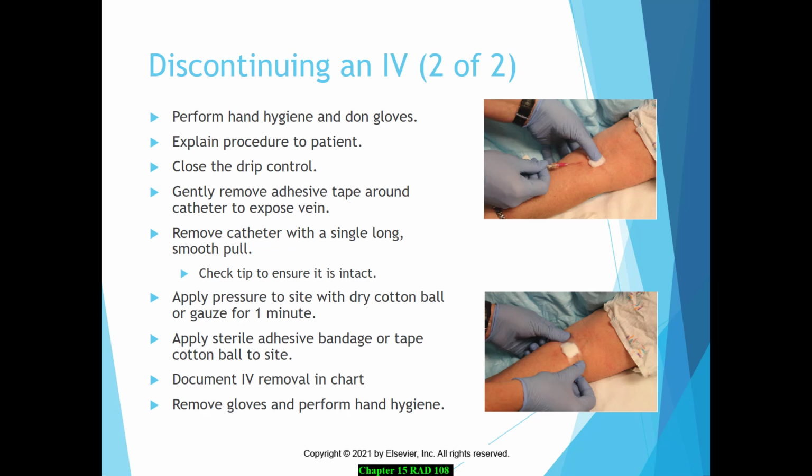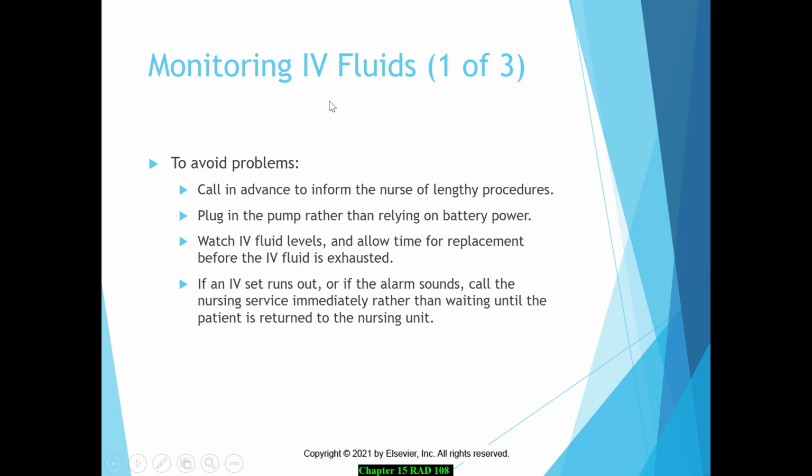When you're taking a look at this video, it also shows you how to put on your gloves, do the injections, and then you're going to end with the Band-Aid on your patient because of the blood.